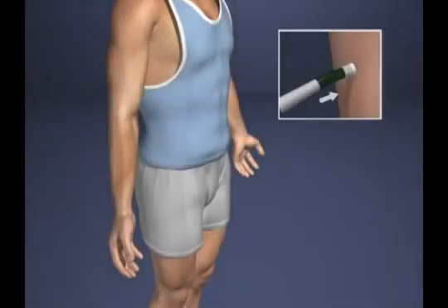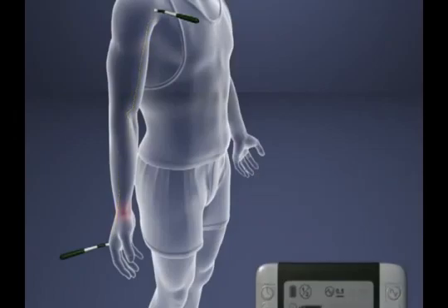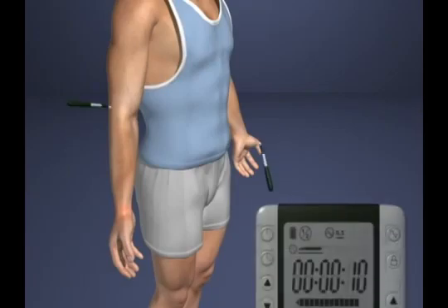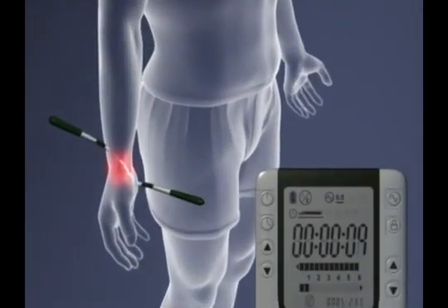Smart Probe Treatment Strategy, Example 3, Arm Pain. Treat beyond the treatment area to encompass the entire arm in at least 2 places. Then treat closer in, around, and through the area being treated for about 1 minute, applying the probes at about 6 different positions.